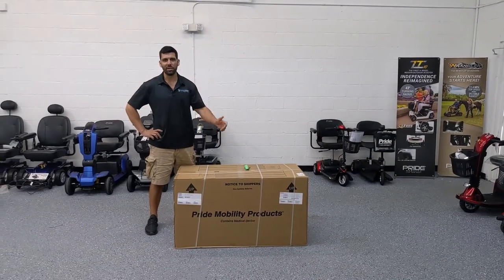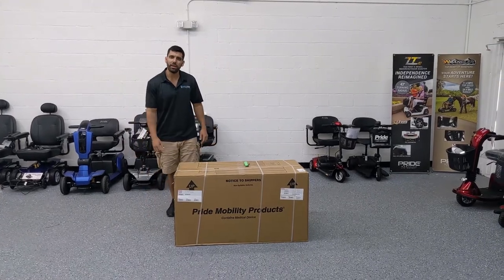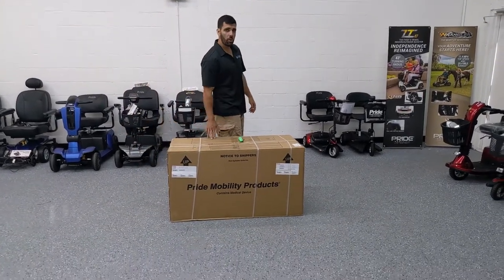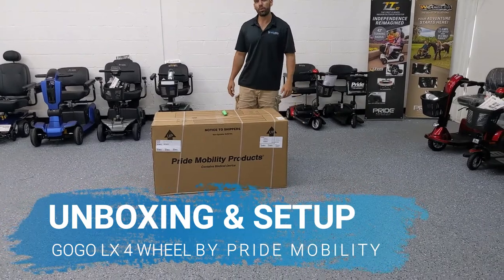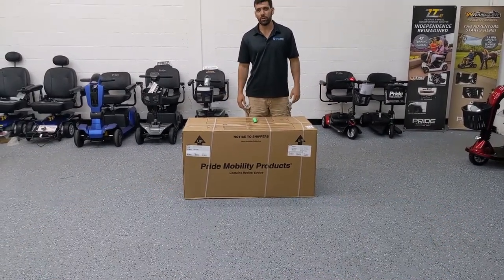Hi everyone, I'm Sergio with Mobility Scooters Direct. Here today to do another unboxing and setup video. Today I have the Gogo LX 4-Wheeled Scooter by Pride Mobility. Setting it up is a breeze — I'm going to show you how to do it. Let's get started.